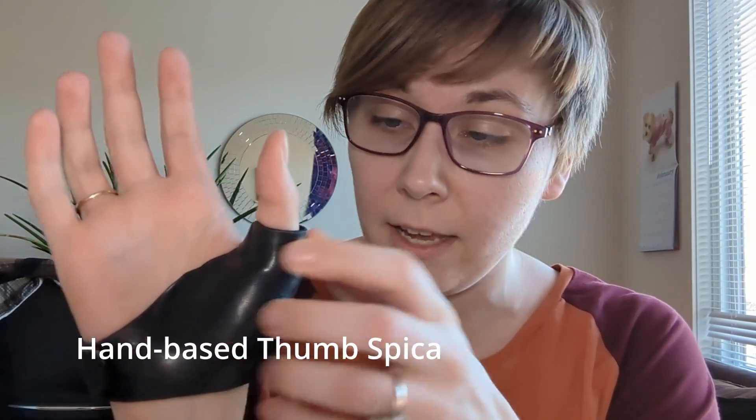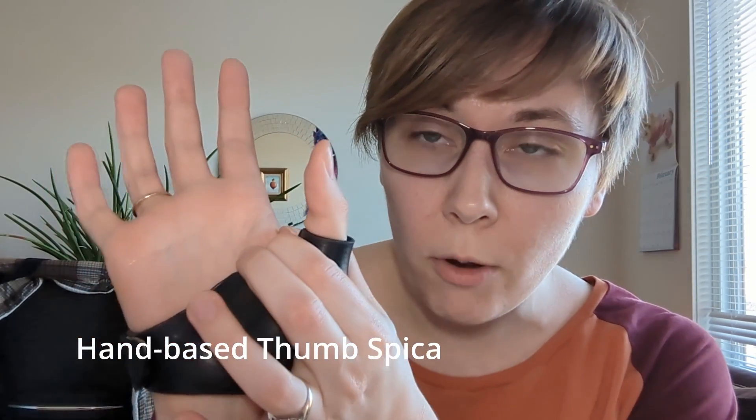We're going to splint it the same either way. For this, I would probably choose a hand-based thumb spica. The most important thing is essentially immobilization of that MCP. Most importantly, we're protecting it from being yanked back and forth. If our injury is a ligament right here, we want to hold that thumb in a protected position so it's not moving around and not pulling that ligament away from where it inserts. It's going to be nice and stable in a splint like this — a hand-based thumb spica.